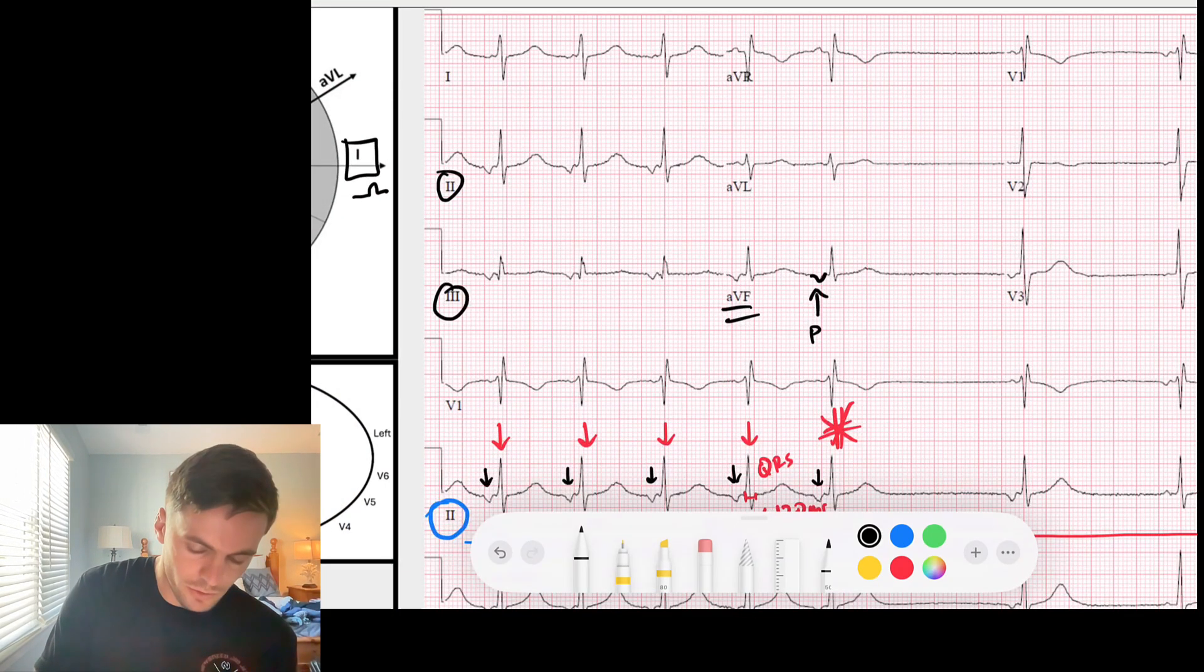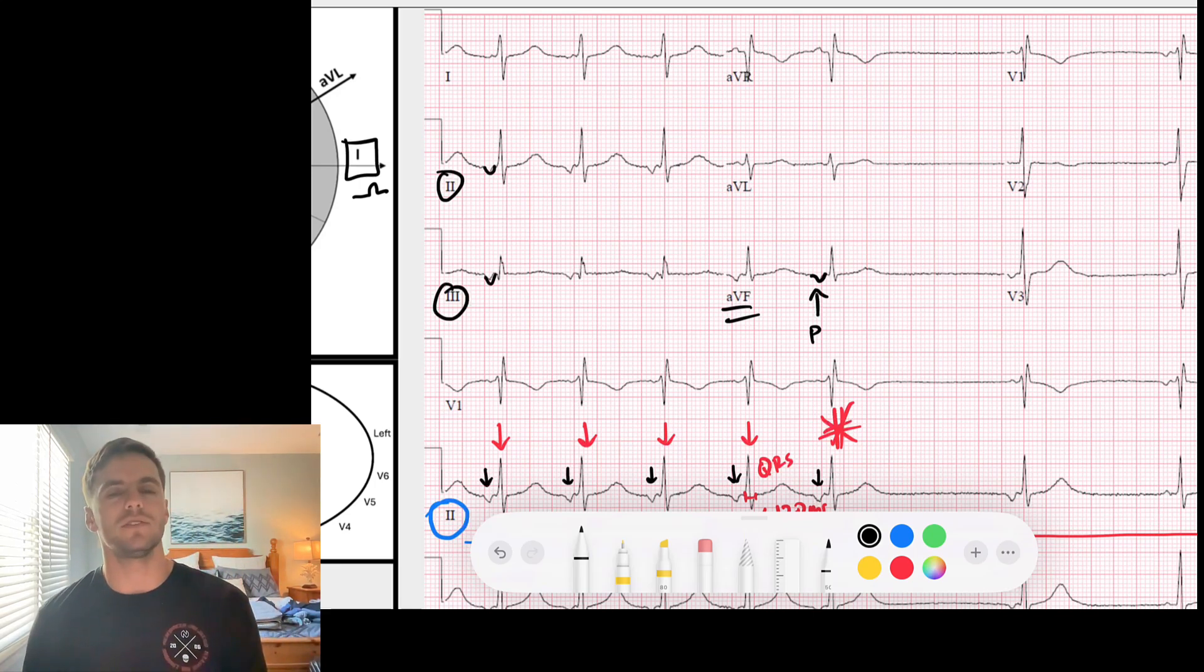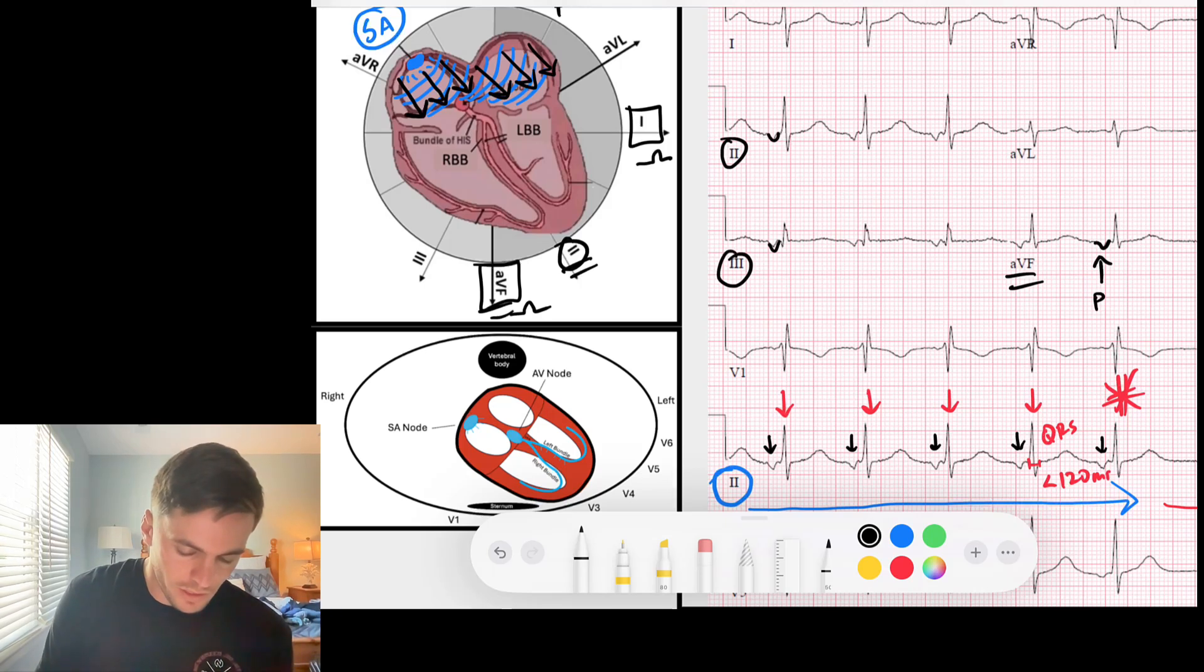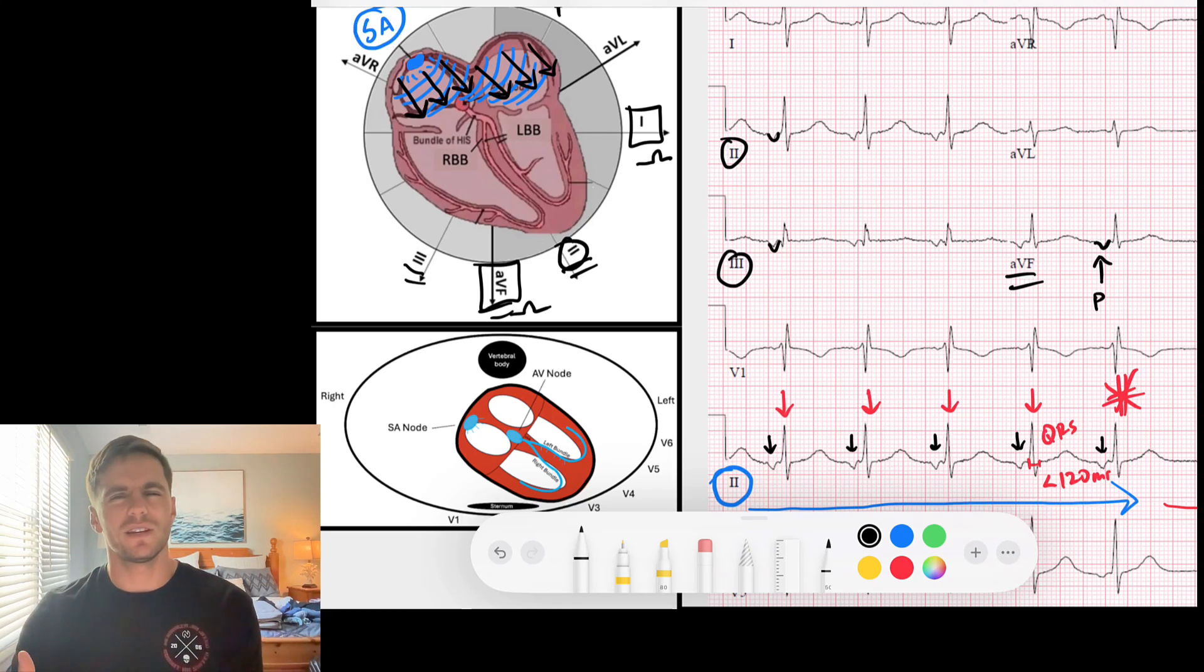And those P waves, I want to make sure that they are of sinus origin. So I look up at lead one and lead AVF, and what I initially notice is that look at lead AVF—look at the P wave here, look at that P wave in AVF, it's inverted. And look at the P wave here in lead three and lead two—they're inverted. So these are negative P waves in the inferior leads, right? Leads two, three, and AVF are inverted. So when P waves are inverted, that means they're going away from those leads.